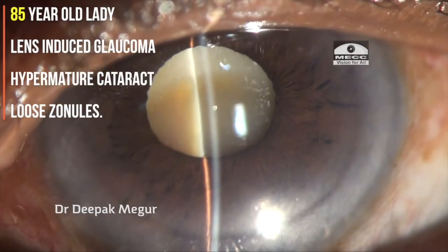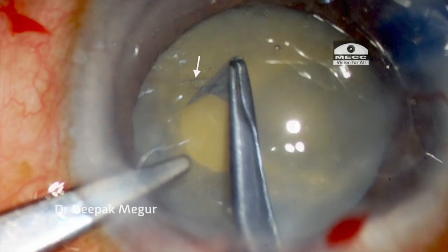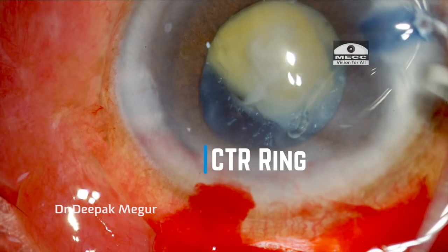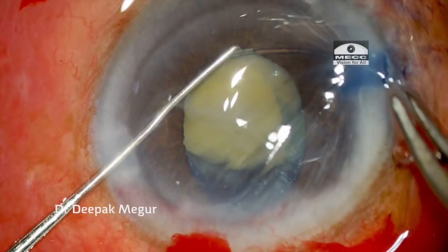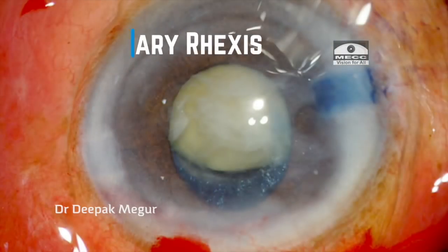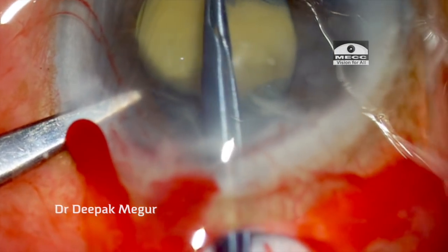Now moving on to the next case — a similar case of Morgagnian cataract with phacolytic glaucoma, hypermature cataract, and loose zonules. As I am trying to do the rhexis, because of extensive generalized weakness of the zonules I can't make a bigger rhexis in the first attempt, as it is going to put stress on the zonules and also end up going to the equator. So after completing the primary rhexis, I am inflating the bag with OVD and then stabilizing the bag using the CTR. This timely intervention really makes the bag and zonules behave differently. The equatorial stretch it imparts helps me to effortlessly perform the secondary larger rhexis, because in majority of SICS cases the complications happen during nucleus manipulation. So: insert the CTR, stabilize the bag, then perform a secondary rhexis.